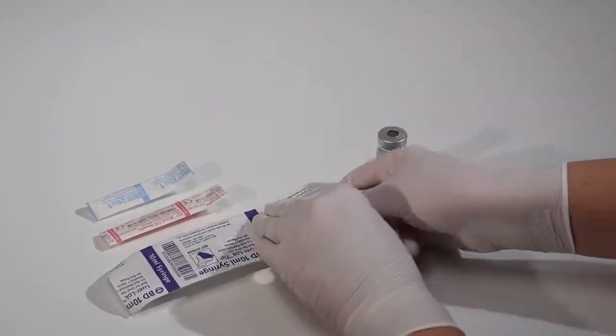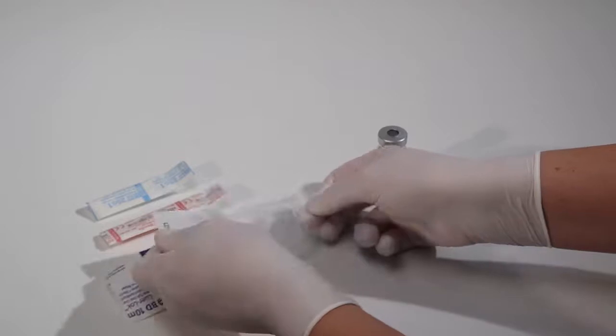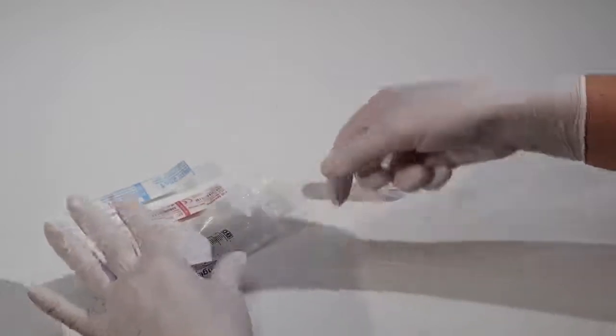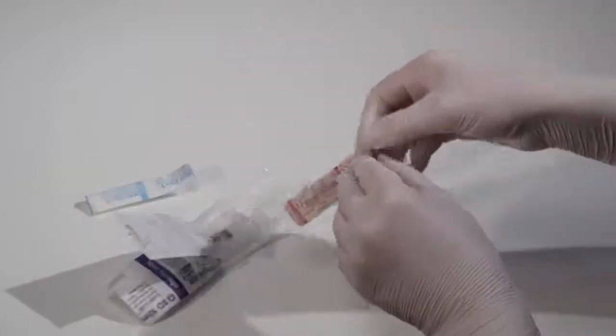Now, open the syringe and blunt fill needle packages by holding the peel tabs and peeling them back only far enough to expose the hub of the needle or the plunger rod of the syringe.